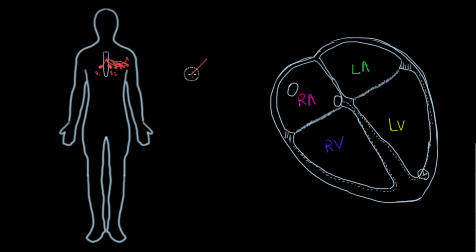So it would kind of look like V1, V2, V3, V4, V5, V6. And how that would look on here, it's a little bit harder to draw again, but imagine you have a heart and then the lead is coming, the tube is coming straight out at you, kind of like this.